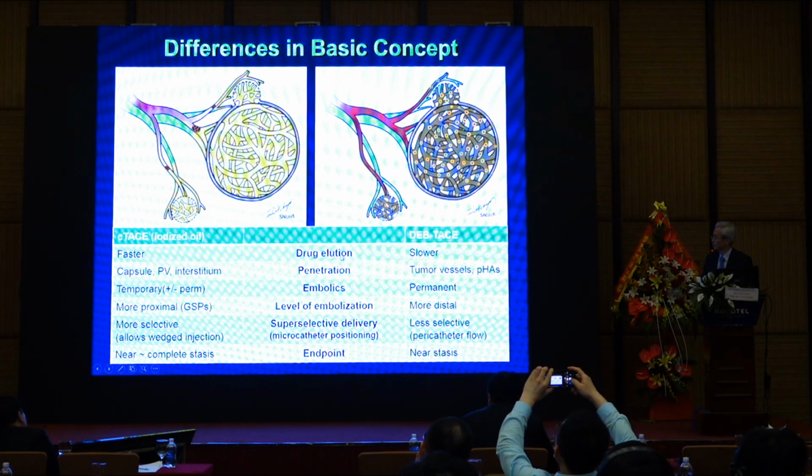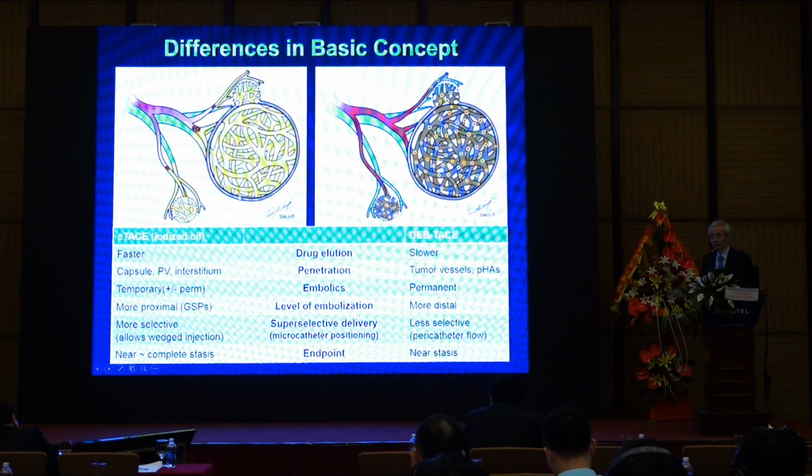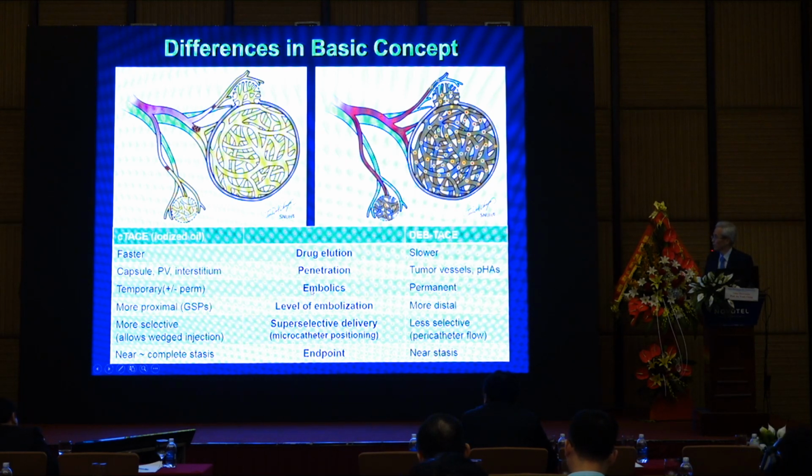Drug elution profile is better in DEB-TACE. Drug is slowly released. If you compare the penetration, the Lipiodol is better because the Lipiodol can enter into the portal vein and tumor capsule, also in the liver capsule. However, drug beads cannot enter into those small vessels.